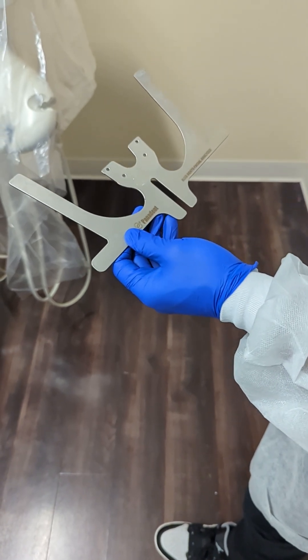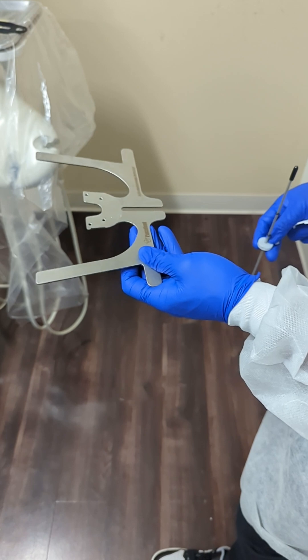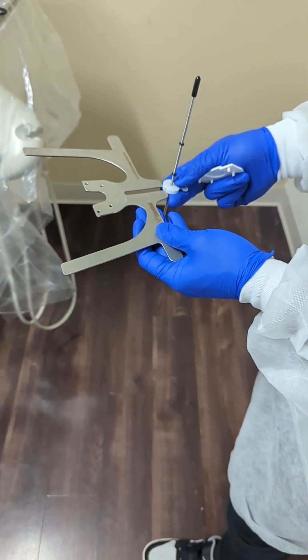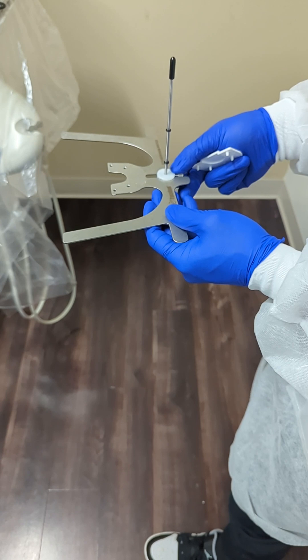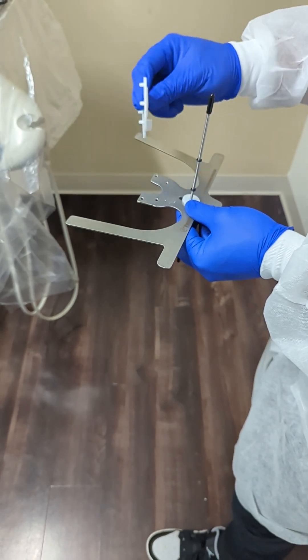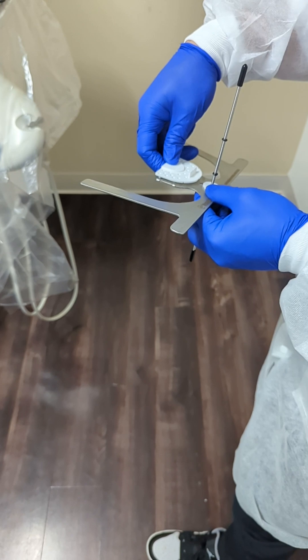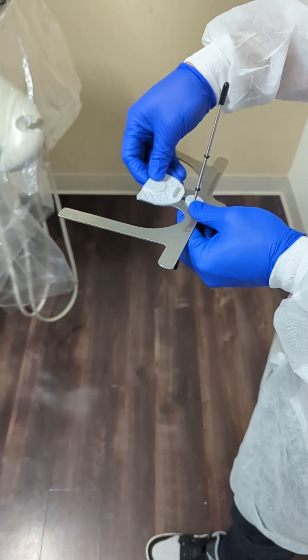We're going to show you how to use this Coist Dental Facial Analyzer. To set it up, you have your horizontal plane here, and then the vertical rod just slips in and out here, so this can adjust for the patient's nose so you don't bump into it. And then you have the plate, and it's got four prongs onto it that index with the plane, and that just kind of snaps in place here.